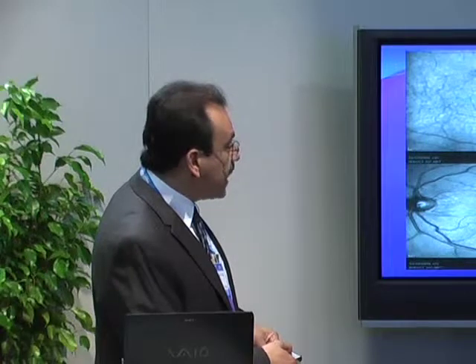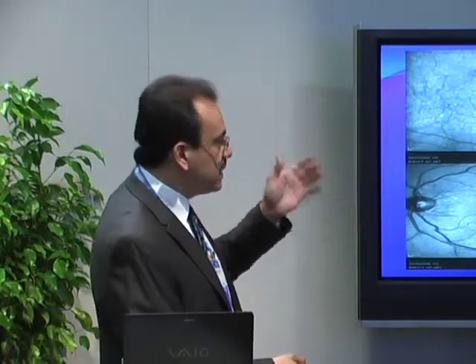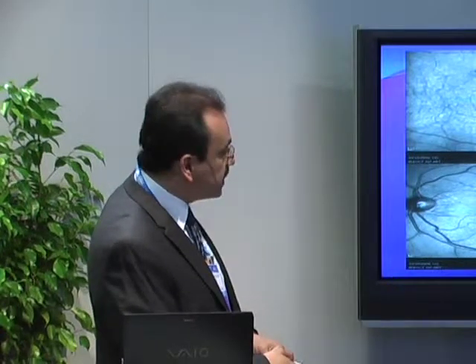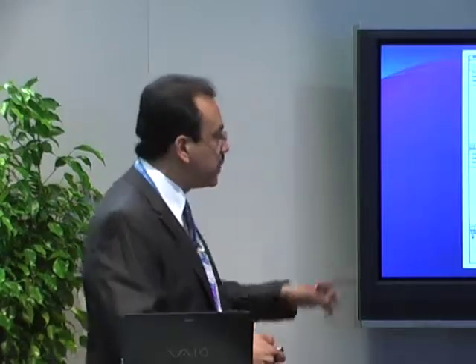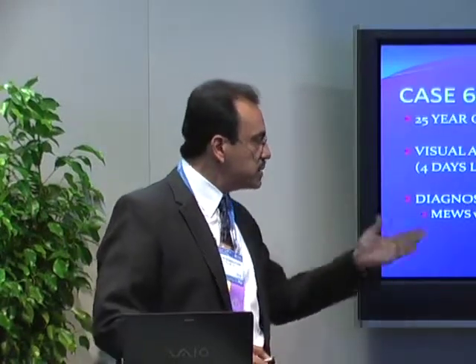So what's probably happening in this patient, and I have not performed a multifocal ERG to test this, but it appears that the nerve fiber layer is gone here. So the photoreceptors are here, but they're not connected, and it's not surprising that the patient is having these complaints. So again, I can give you multiple examples.